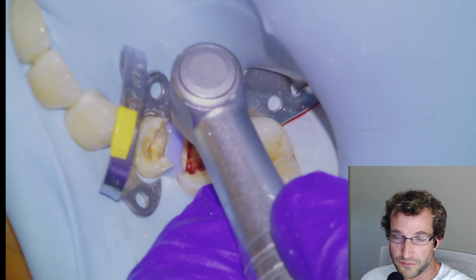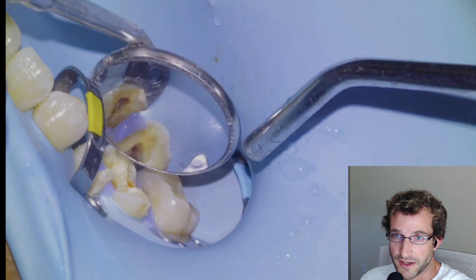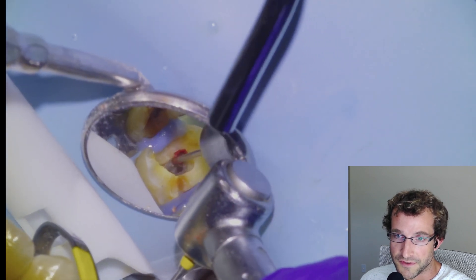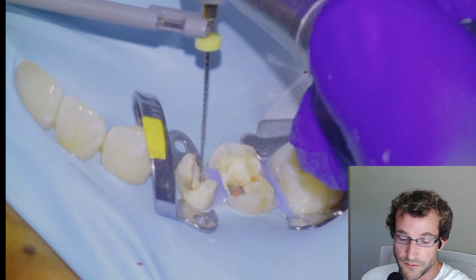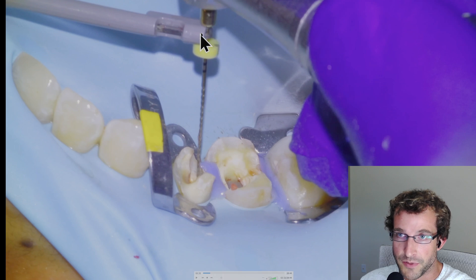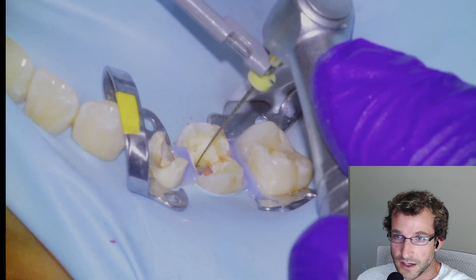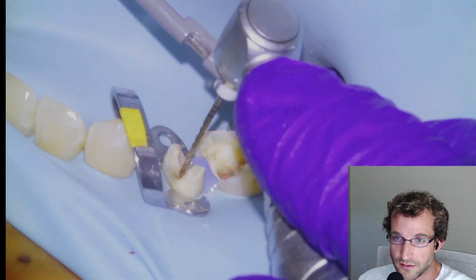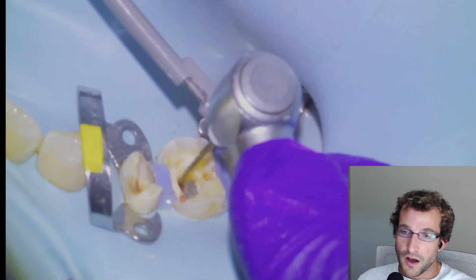The 1-6 was still vital but like I said, it was irreversible pulpitis. Then we'll start instrumenting the teeth. This is a young patient, the 1-6 is vital, we're going to have wide open canals. So we're just going to start off with our SX drill and get down all five canals. I'll typically search for an MB-2 later on in the process, but we're just going to open up the orifice of the MB-1. We searched for an MB-2 right now but didn't see anything. So we'll take our glide path file and clip our apex locator to it, then take it down to length until the apex locator indicates it's at the end of the tooth.